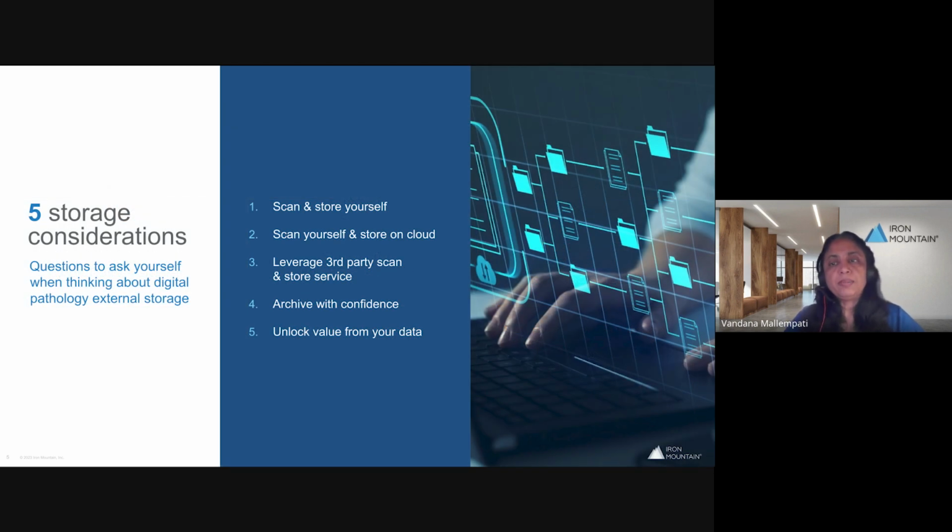Storage challenges can be a considerable problem for customers as they try to adopt digital pathology because the image size is so significant for pathology images when you compare to other imaging that happens regularly in a hospital or a research facility. Pathology images, as I mentioned earlier, can be anywhere between a gigabyte to around 9 gigabytes based on the magnification.